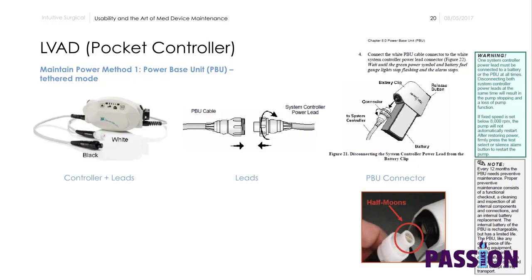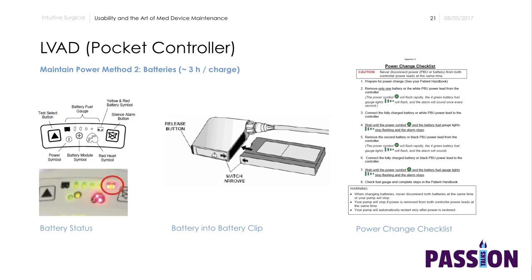Just to illustrate part of the use of the device: when they go to sleep, they probably get off the batteries and plug into a wall, so this is a wall-based unit. I have not personally worked with these devices extensively, but it was eye-opening to see all the connections and special connectors. There's even a connector that's keyed so it fits in only a certain way. And I'm sure there's a very important design reason why it must go in that configuration.